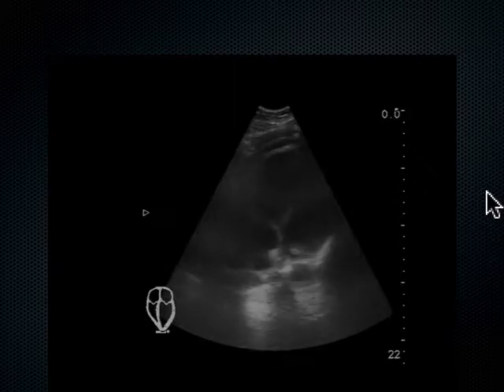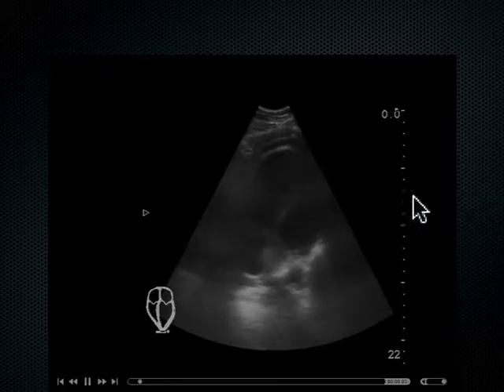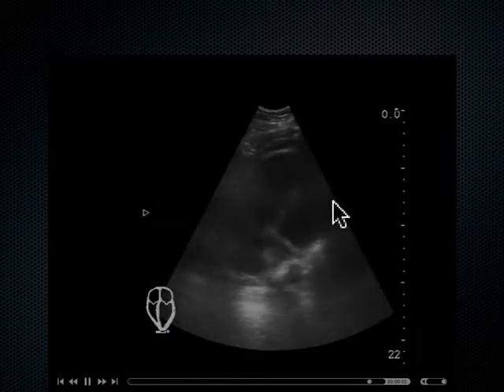I don't know why they're not having a carotid pulse. It's not enough blood pressure to make a carotid pulse, but about 30% of the time, you will see organized cardiac activity like this, yet no carotid pulse. I shouldn't say good cardiac activity. This is very weak cardiac activity. But what do we see here? This is actually trying to be an apical four-chambered view. It's a little bit off to the side.